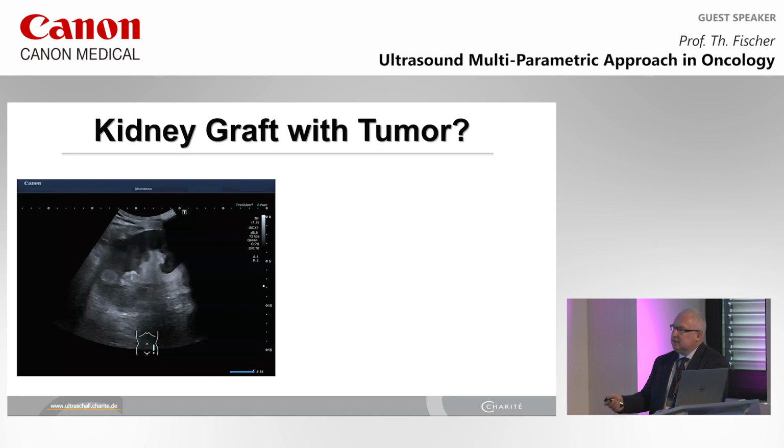Looks quite similar, but this is a horrible situation because this is 3 days after a kidney graft. So that means we are picking up a lesion. And the patient asked me, so Professor Fischer, is this a problem, yes or no? So I was able to get my phone and call the surgeon, but he was on vacation. So that was a horrible scenario.